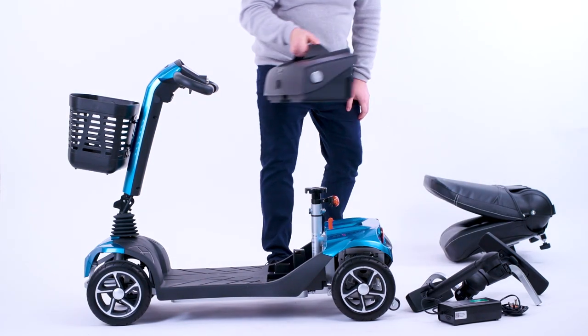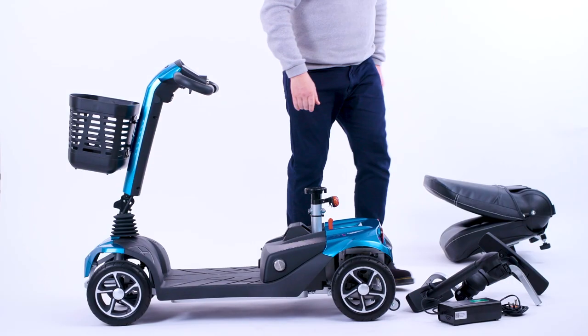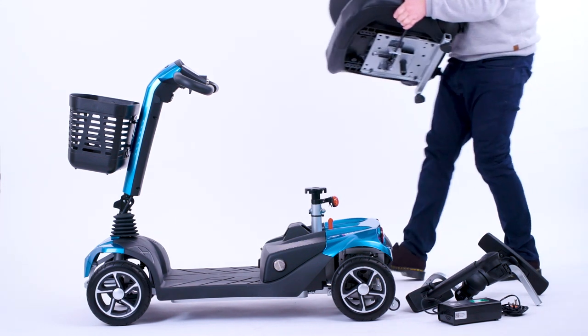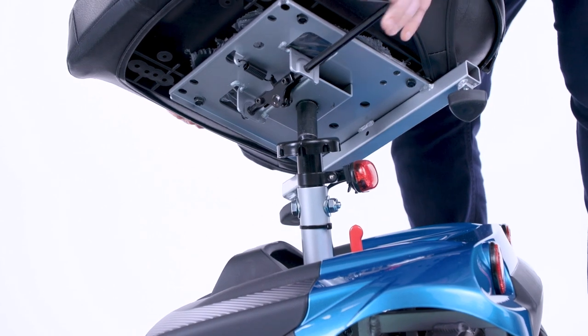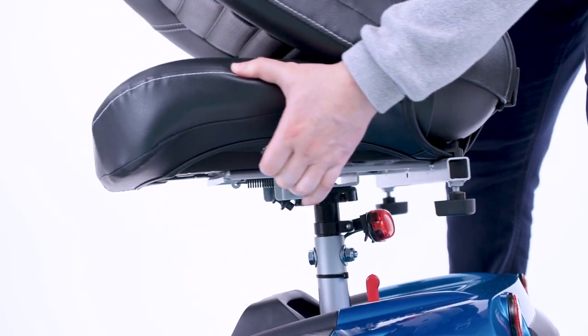Next, add the battery pack. Now place the seat onto the seat post. You'll need to lift the handle underneath the seat to lock it into position.